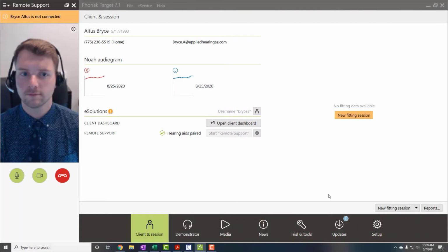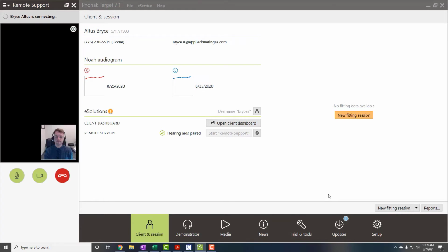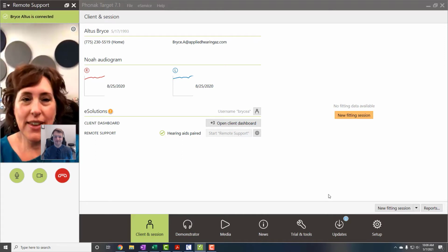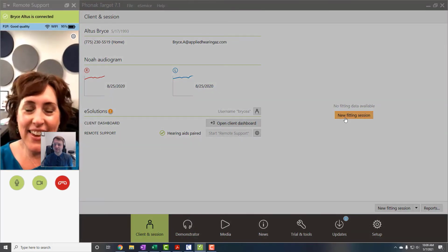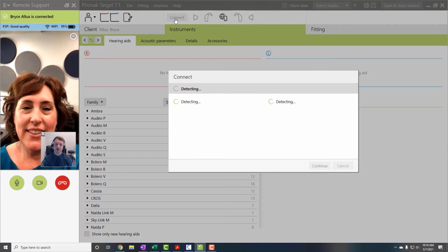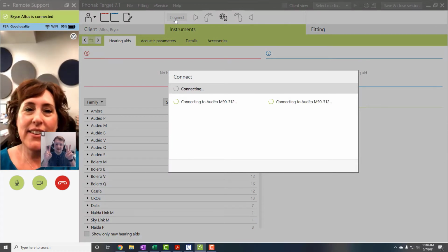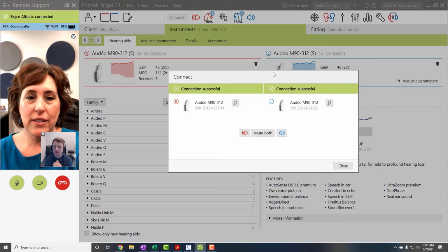Once we've successfully connected and we've started the remote session, you'll start to hear us through your phone's speaker instead of hearing us streamed directly through your hearing aids like a typical phone conversation. And that's intentional. When in a remote session, the Bluetooth connection is only used by your hearing care professional for the purposes of checking your programming in the programming software, checking your data logging, and making programming changes and adjustments.